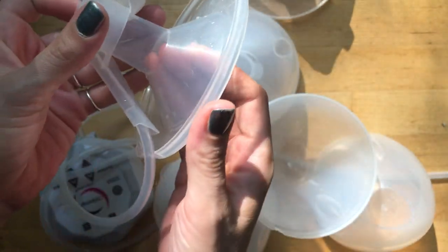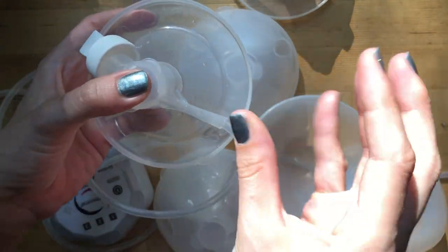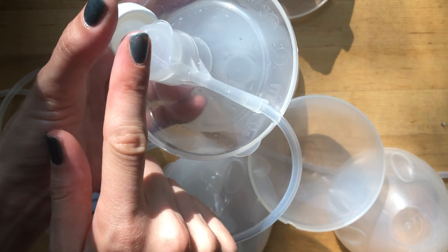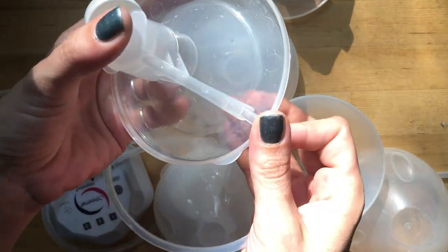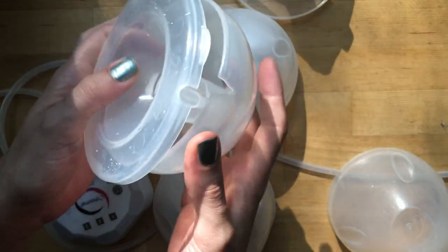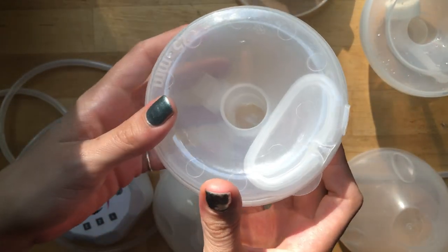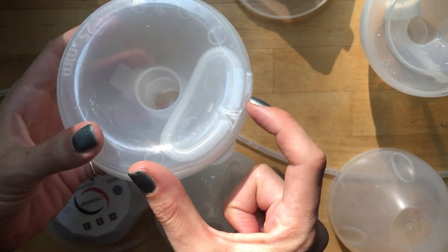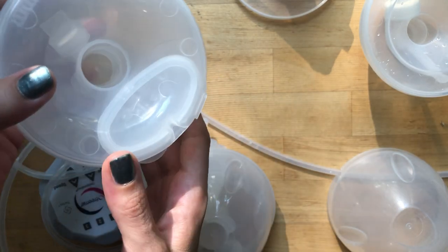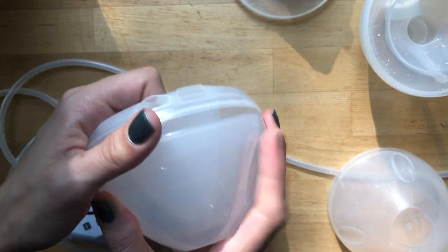The reason they made the change to the air bladder was that with the older version, if you were bending over or reclining even slightly, it would suck fluid up into the tubing and into the pump. The bladder acts as a barrier to fix that, so I do prefer the newer ones for that reason. When you're done pumping, there's a little opening and you just tip it into whatever container - a bottle or a bag - and you're done.